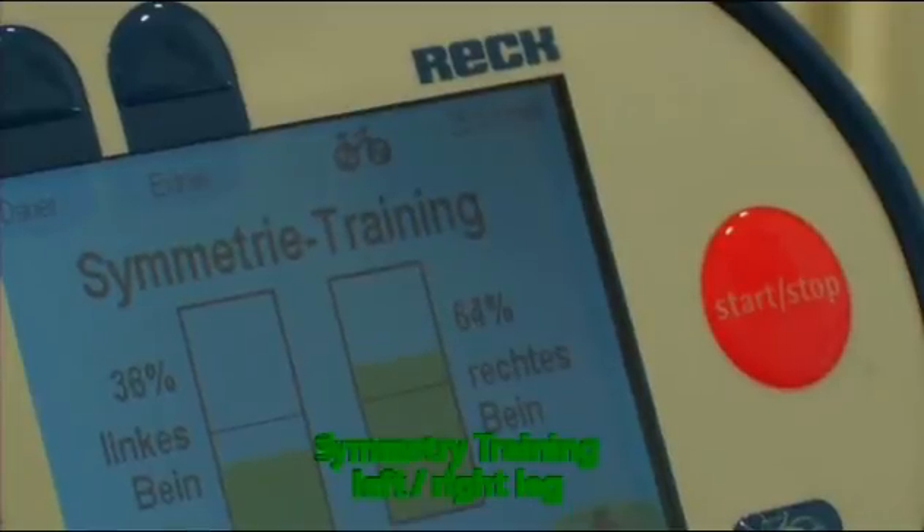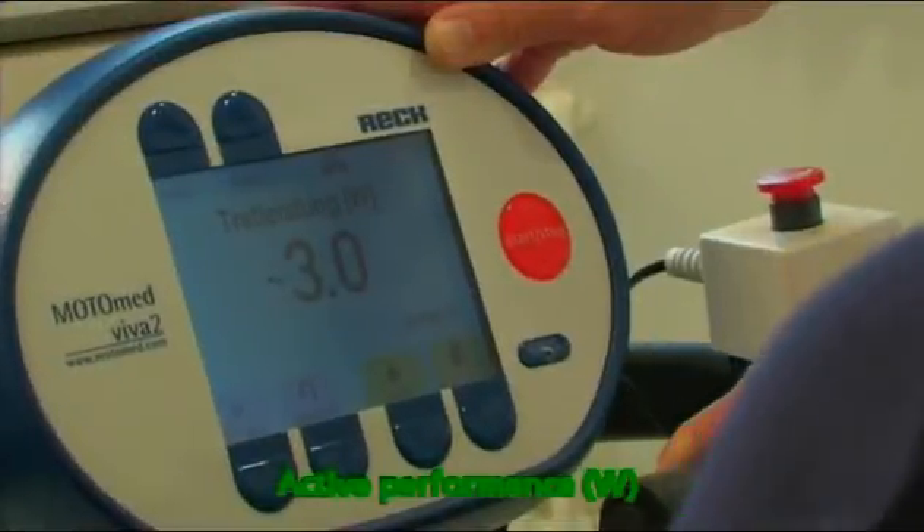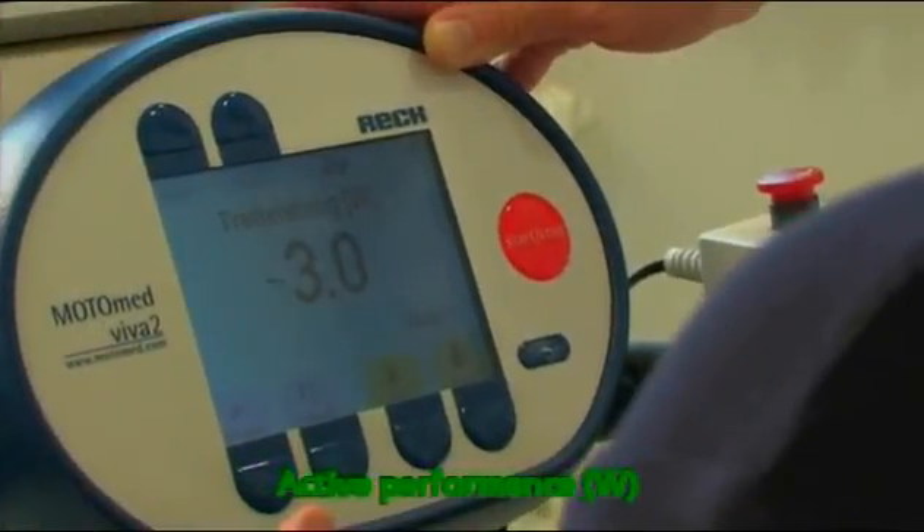Electrical stimulation can be added to many MotoMed motion trainers retroactively. Studies indicate that electrical stimulation after impairment of the limbs' function can retard muscle atrophy and therefore accelerate the entire rehabilitation process.